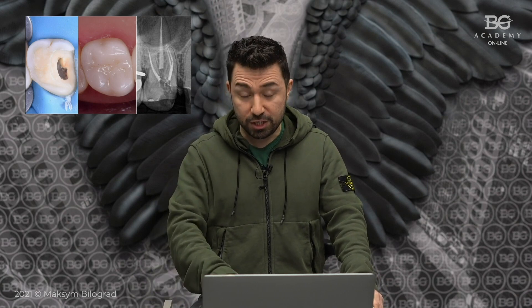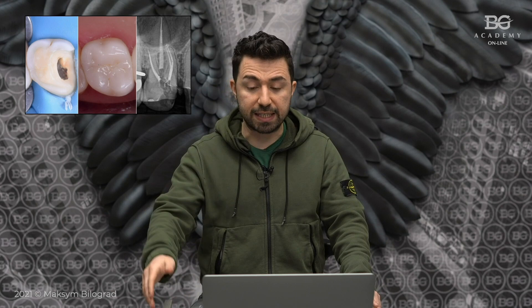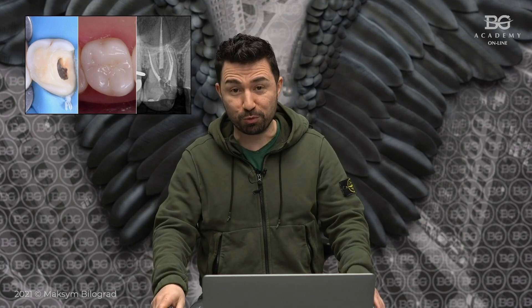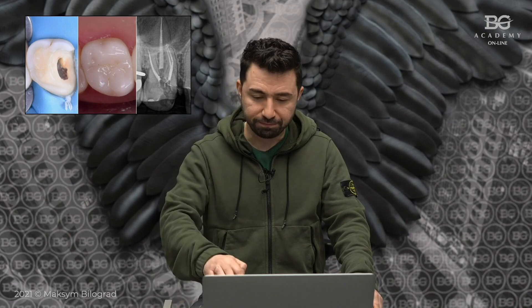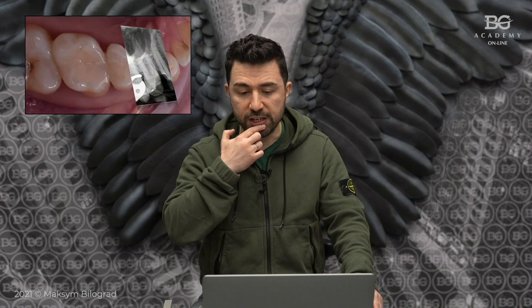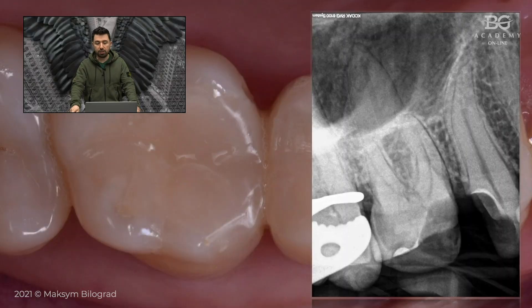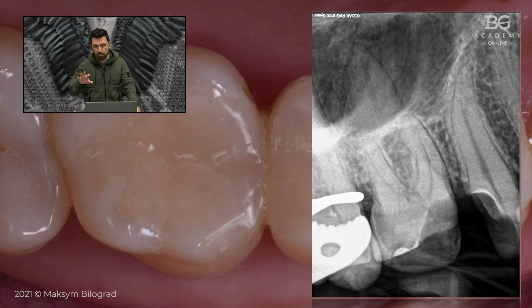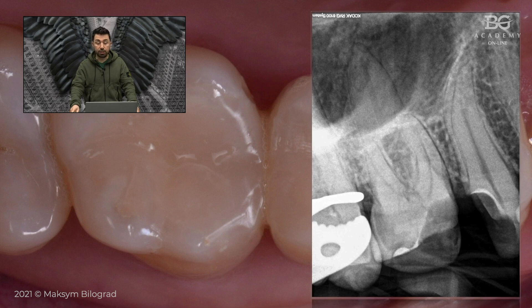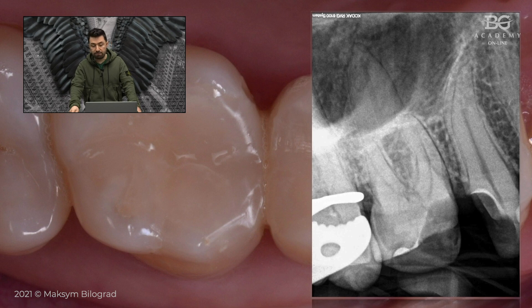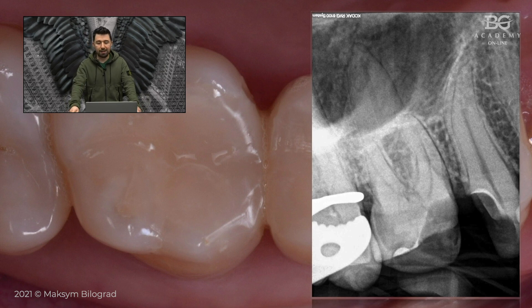Before I discuss the case, I'd like to remind you not to forget to put likes and to sign up to our YouTube channel. Here is the initial situation: we have chronic pulpitis. The patient's complaint was that from time to time she had some pain and sensitivity on that tooth. Since the patient is going to have a full mouth rehab case, we decided to be very careful and attentive with this tooth. We were able to find the pulpitis during preparation of caries defects and provide endodontic treatment.